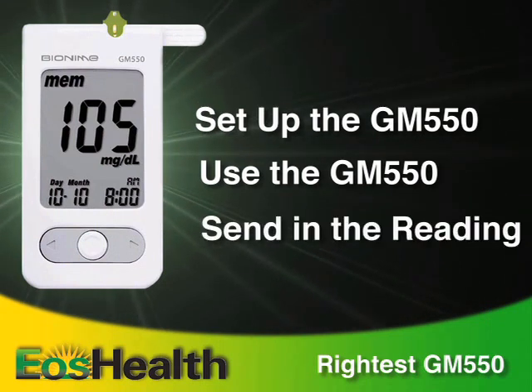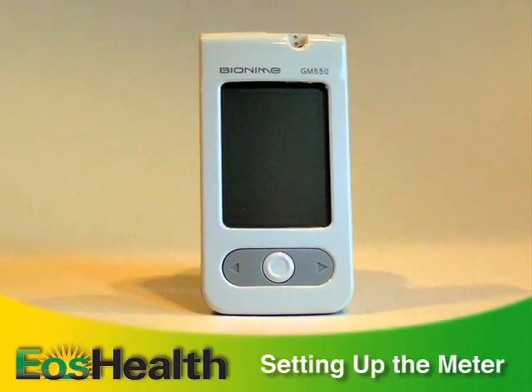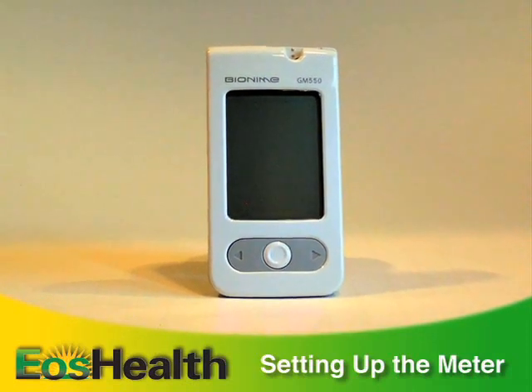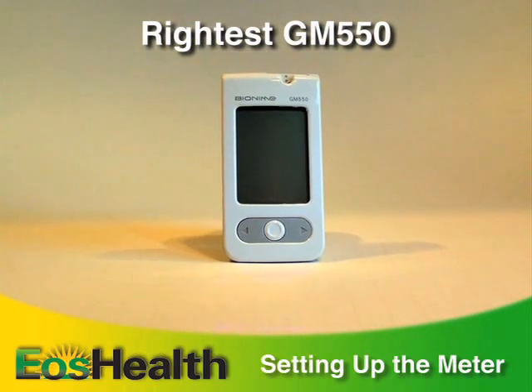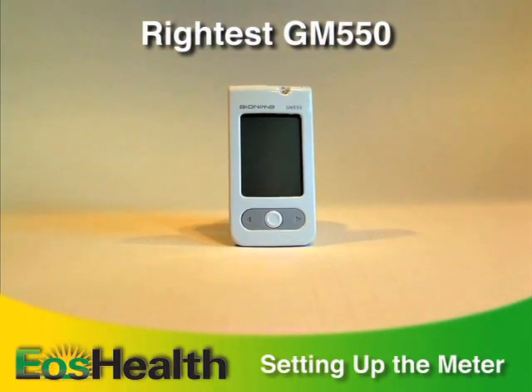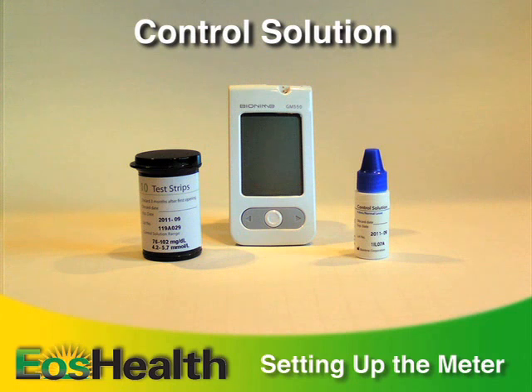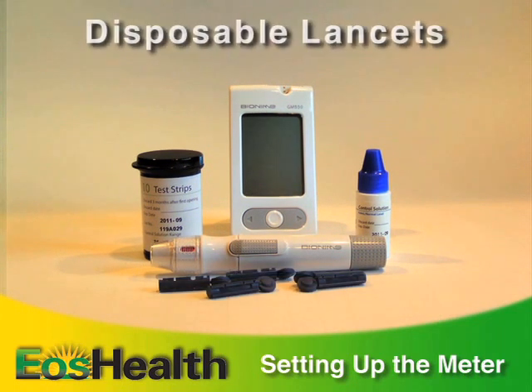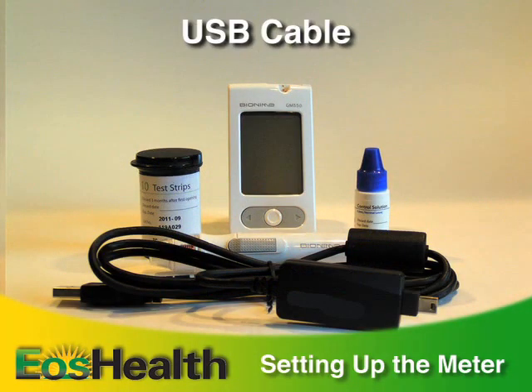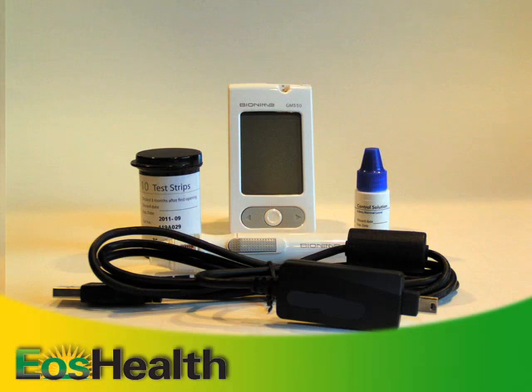Let's get started. There are many different types of glucose meters. We'll be using the Right Test GM 550 blood glucose monitoring system — GM 550 for short. It consists of the meter, a package of test strips, a bottle of control solution, the lancing device, disposable lancets, and a cable for connecting to your PC. Only use the supplied test strips with the GM 550 meter.